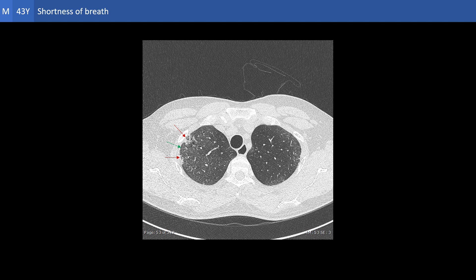Is it possible to appreciate the scleroderma band sign on CT sections, or is it only a sign to be seen on volume-rendered images? The answer is yes, it is possible to recognize the sign on CT sections, but it is far more obvious and impressive on the 3D images. The red arrows show the bands of infiltration and the green arrow the relatively spared band between the two. On the next section you can see the continuity of the bands of infiltration and also the continuity of the spared band between them.